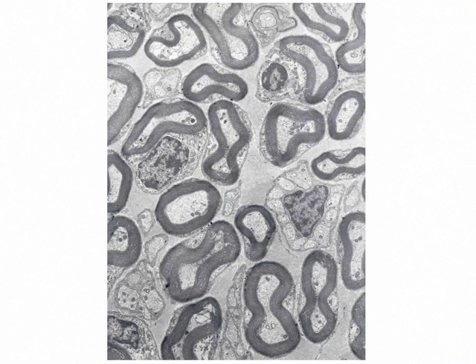Now we are looking at an electron micrograph, and it's a relatively low magnification electron micrograph because you can see entire cells, and here's a nucleus, there's a nucleus. And you notice this very thick, dark staining structure. This is myelin. These are the membranes of the Schwann cell. Here is the nucleus of the Schwann cell. Here is the cytoplasm of the Schwann cell. And here is myelin, which represents many, many layers of the Schwann cell plasma membrane.